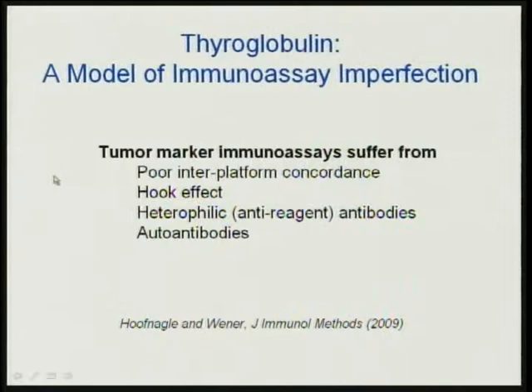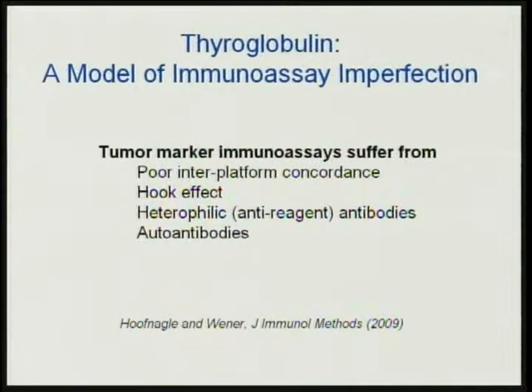This is just the model of immunoassay imperfection. There are a number of problems which Mark Wenner and I recently published in a review in the Journal of Immunological Methods — the title is 'The Fundamental Flaws of Immunoassays.' Let me talk about these four ways that immunoassays — and I'm going to focus on tumor marker immunoassays — really suffer. The first is poor interplatform concordance: the idea that if we measure the assay on one system and then go across town and measure on another system, we'll get two different answers for the same specimen. Something called the hook effect, heterophilic or anti-reagent antibodies, and autoantibodies as well.